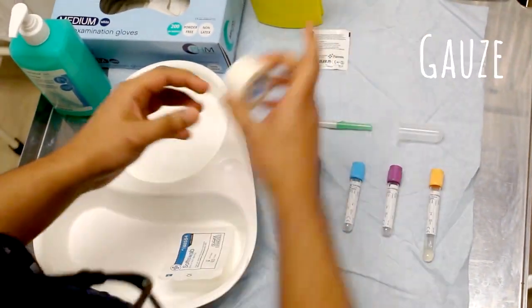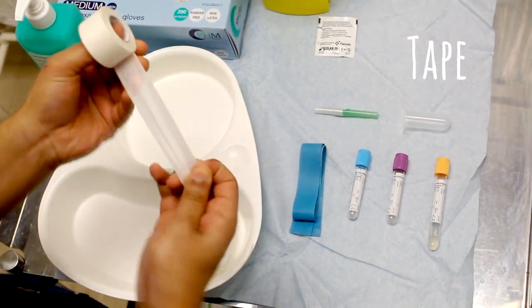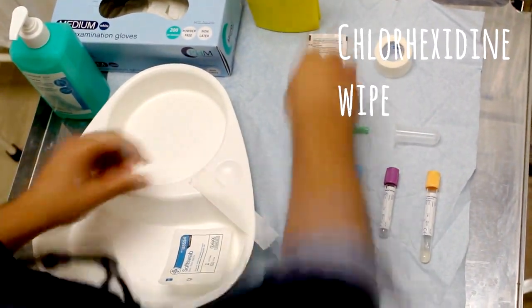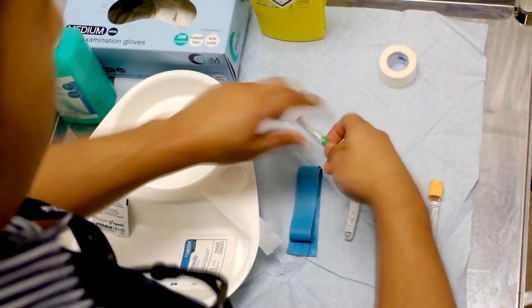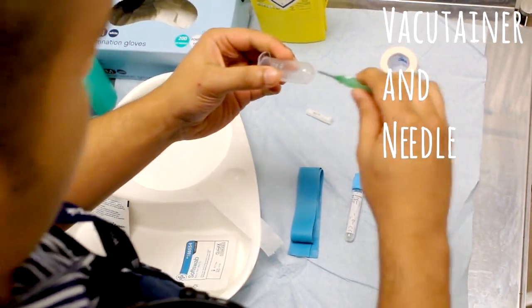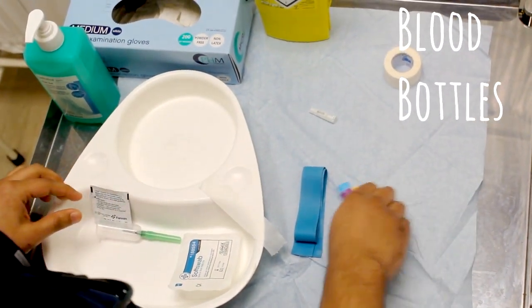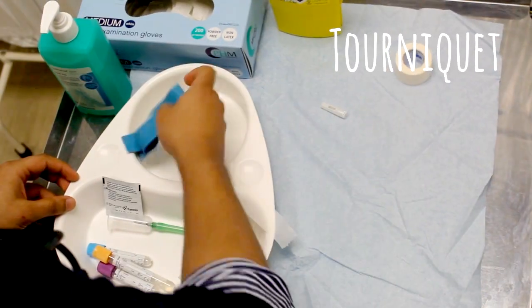Getting your equipment ready — it's a good idea to get it ready before you go to the patient. This saves on faffing around near the patient, which can create a bit of anxiety. You've already got your things ready and it's going to look slick because you arrive and can crack on with the job.